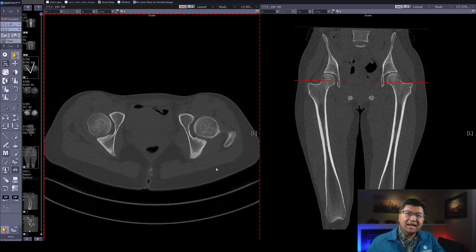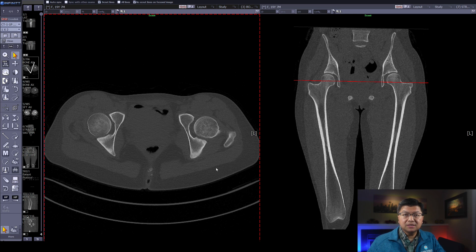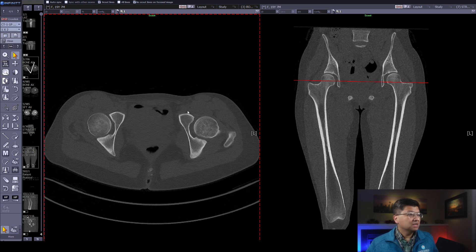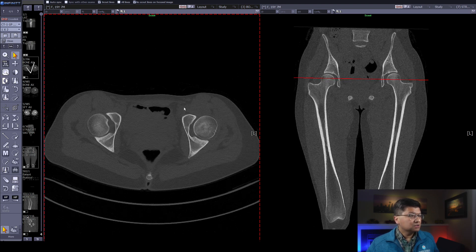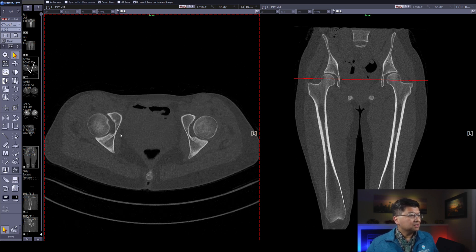On the left we have an axial set of images going from the iliac crest down to the femoral condyles. On the right we have coronal reconstructions from that original data set. The first thing I want to show you is how to measure acetabular version. I'm going to take the right side. As I scroll up and down on the left images, the red bar on the right tells you exactly where we are. I'm going to go to somewhere in the mid aspect of the femoral head. You'll notice the patient isn't completely flat to the table, so we have to take that into account when we make our measurement.